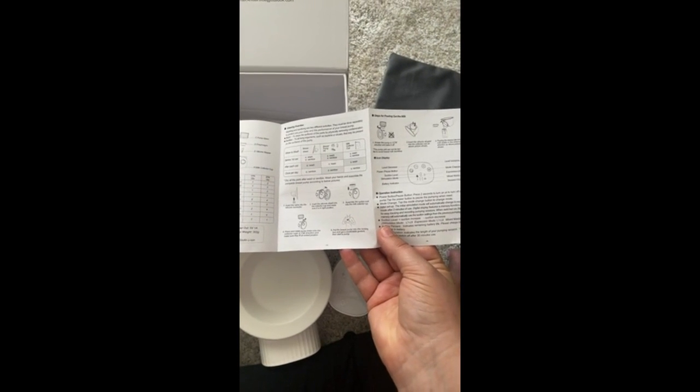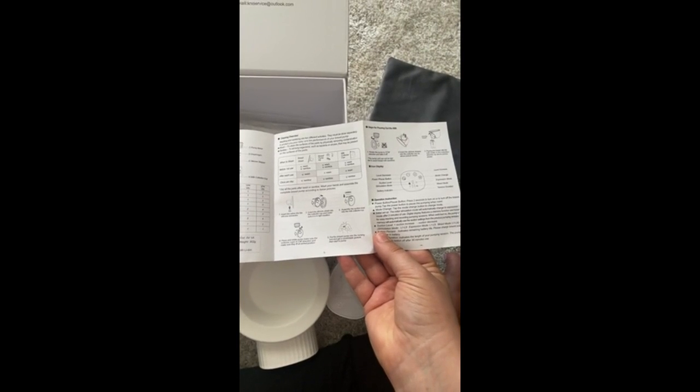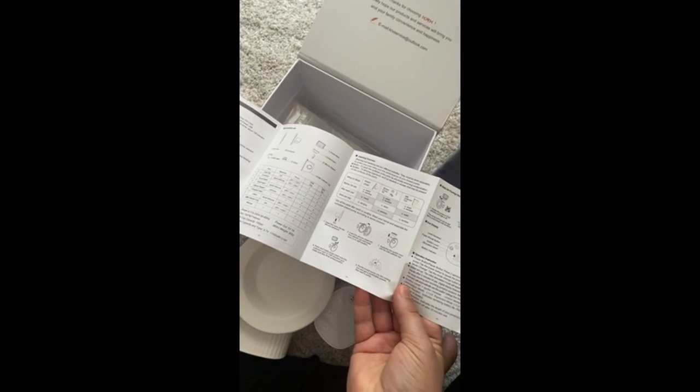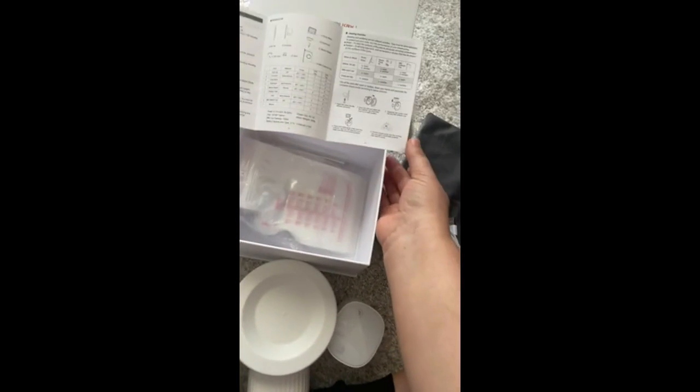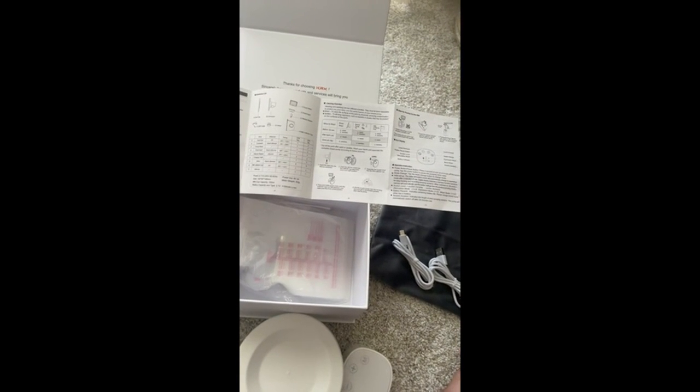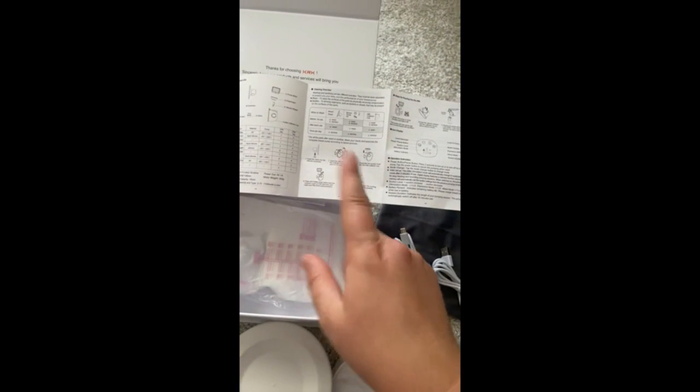They think that they are a bigger size. Before, the typical average size was a 24 millimeter, but actually what we're seeing, the recommendations and the guidelines are changing, at least here in the US, with flange fitting, that a lot of mamas are actually smaller. A 19 or a 22 is actually a normal, typical average size nipple. So I do think that they should add in how to properly measure for what flange you need.